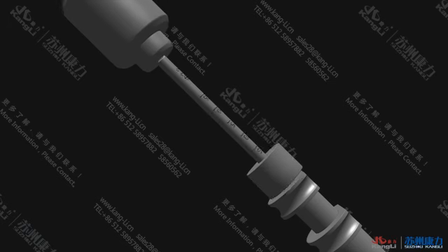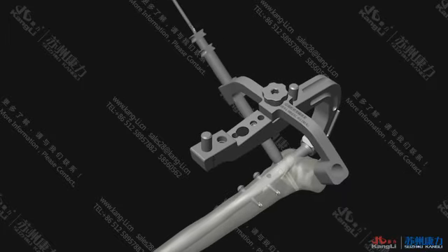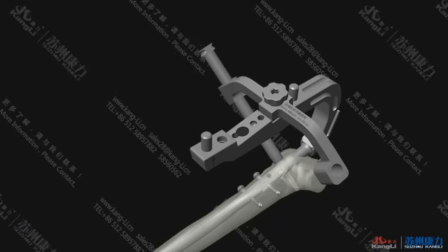Then continue drilling until the contralateral bone cortex is drilled through. Remove the phi 3.2 drill bit and the inner sleeve. Keep the outer sleeve closely contacted with the bone cortex and insert the guide depth gauge to measure the diameter of the bone. Choose the phi 5.0 locking screw with appropriate length and screw into with the 3.5 hexagonal screwdriver.